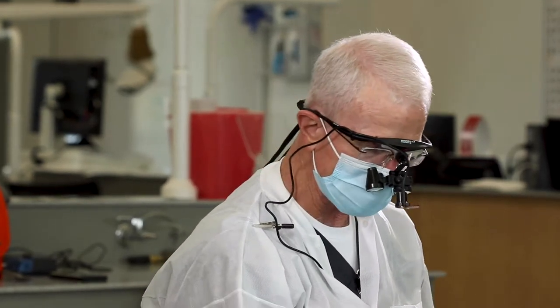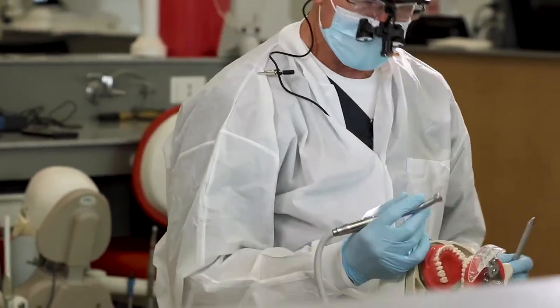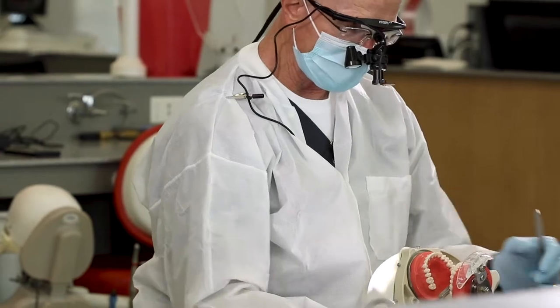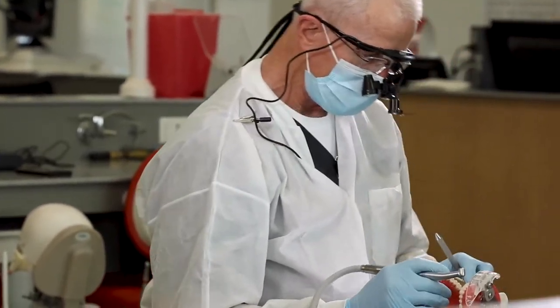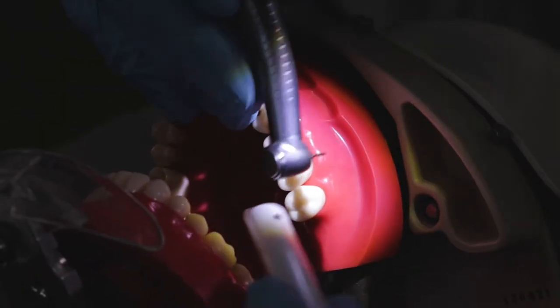One of the things I like to do when working interproximally is work with direct vision — I don't like to be looking through a mirror when doing that. I want direct vision so that I can avoid nicking or scraping the adjacent tooth. On this tooth we'd have our patient turn to the right, the patient's right, and then come over into the one o'clock position for direct vision. We're going to break proximal contact — I'll start with the distal and just use little brush strokes.